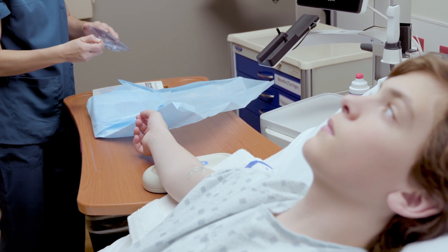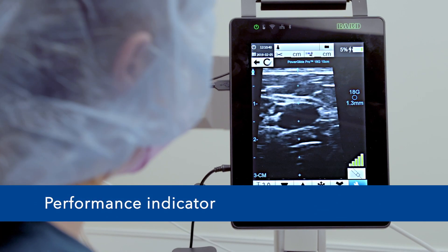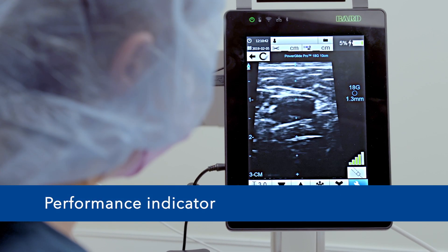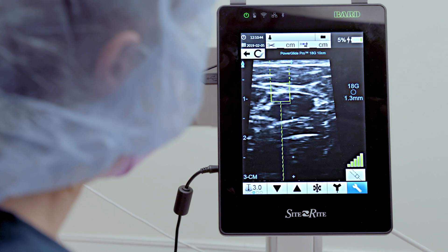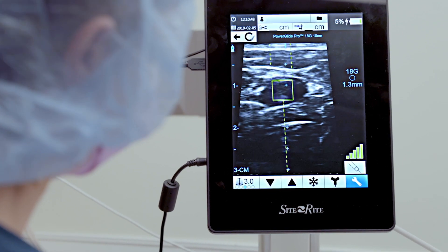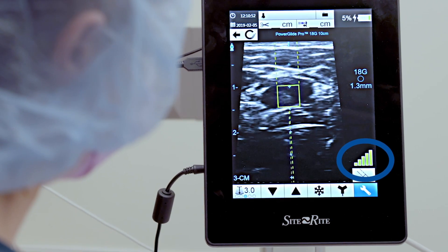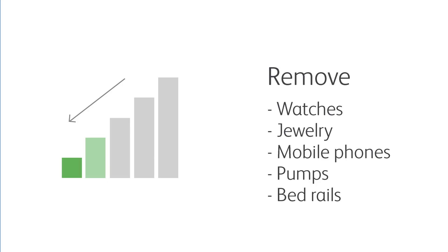Drop the needle into your sterile field and proceed with your normal insertion prep. Before you begin your procedure, check the performance indicator to ensure there is an adequate magnetic environment for needle tracking. You can find the performance indicator on screen here. More bars indicate a cleaner magnetic environment for detecting an activated needle. If the performance indicator is low, look for metal and magnetic objects and remove them from the field. These could include watches, jewelry, mobile phones, pumps, and bed rails.